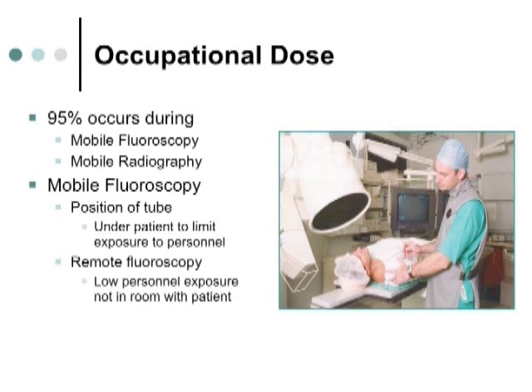The position of the tube, you want the tube, like I said before, the x-ray tube should be under the table and the II tube above the table, although this is not a great setup, okay? So you're a cardiologist, what's wrong with this setup that you can think of? That x-ray tube would be right beside on the side. X-ray tube's down here, okay, here's your II tube. It's too far away. Okay, this is too far away, that's exactly right.